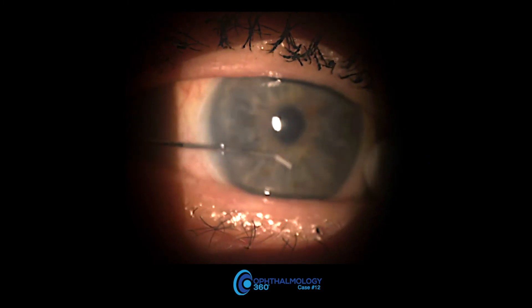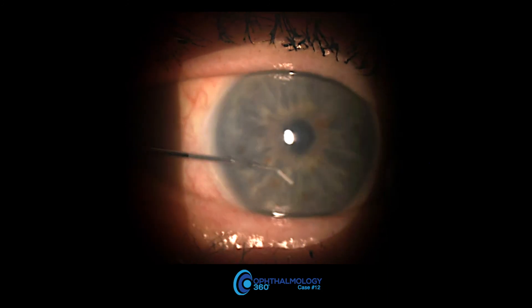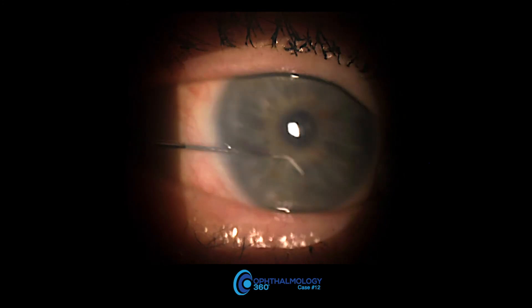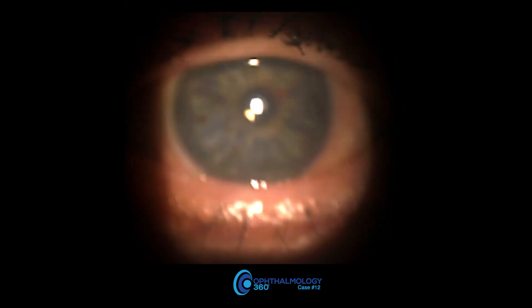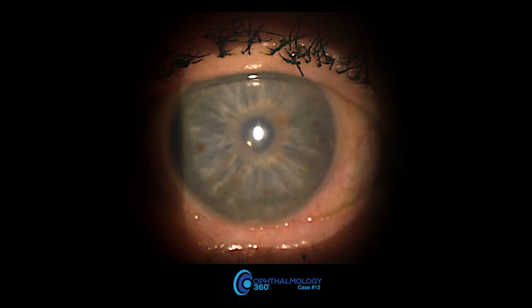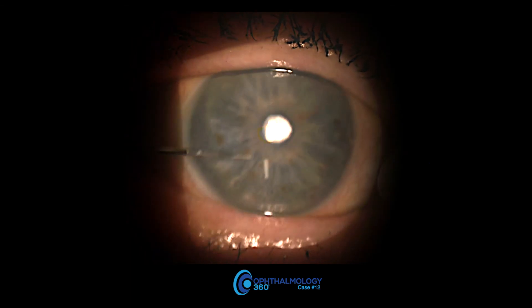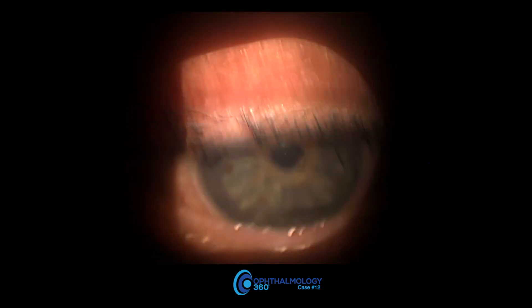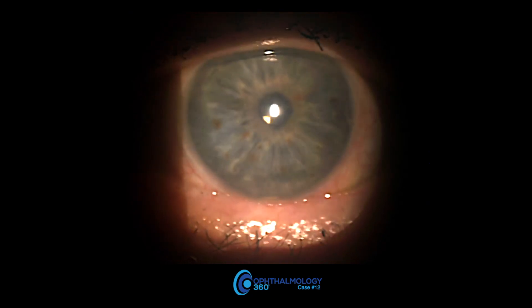Often the injector will slowly release the implant. Sometimes air bubbles will shoot the implant straight up to 12 o'clock — it's rare, but it happens. It will eventually find its home in a very short period of time. If it is stuck to the injector, we'll roll it around a little bit — I'll show you those in some other videos. After this, it's painless. It takes about 12 seconds. Patients are surprised, happy, and thankful.